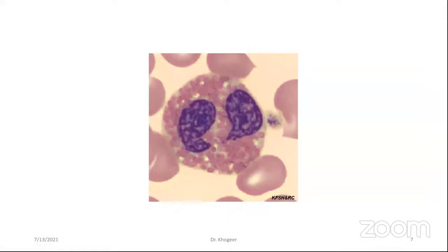Eosinophil is characterized by coarse orange-red granules of uniform size, and is similar to a neutrophil in diameter. Normally, the nucleus demonstrates condensed chromatin and nuclear segmentation with 2 and sometimes 3 nuclear lobes.